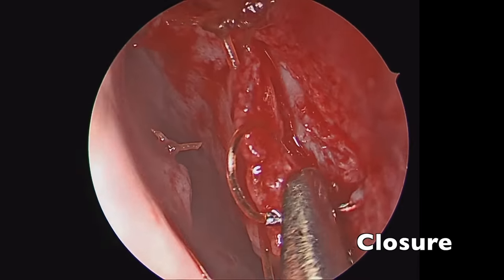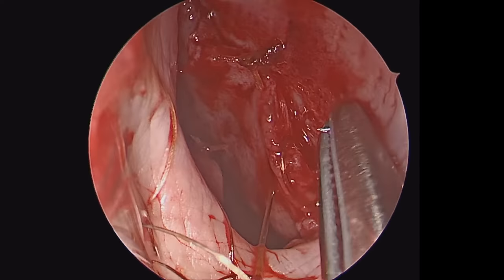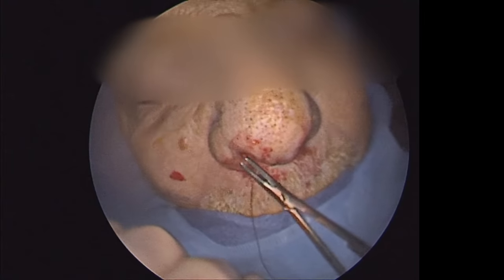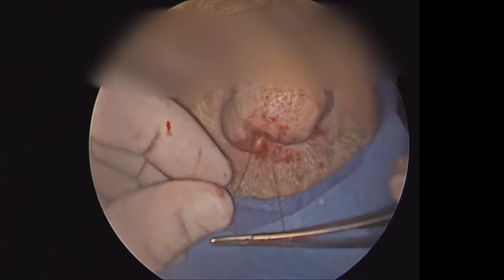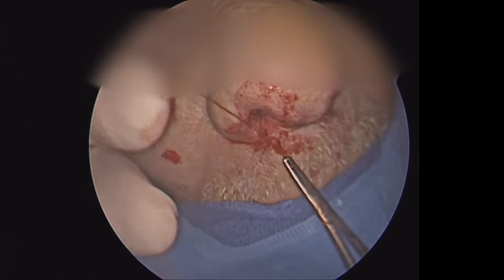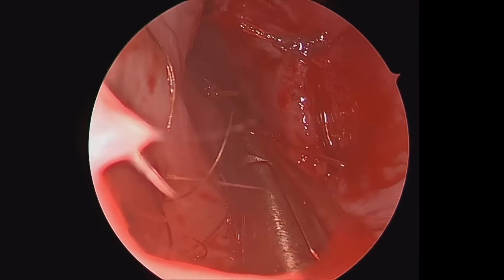I'm using a 4-0 chromic suture with a curved needle. I start with the back portion of the septal incision and use two throws to close this with simple interrupted sutures. I start the tie outside the nose, then tie it down and re-grab the tail closer to the nostril, pushing the tail into the nose to tighten the knot.